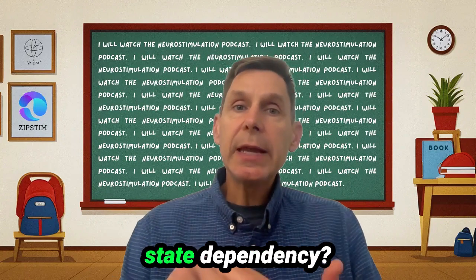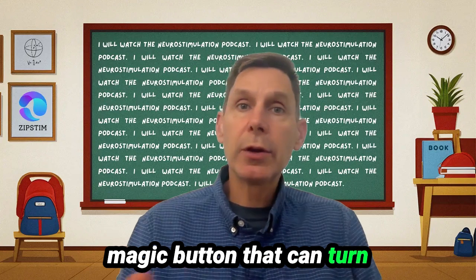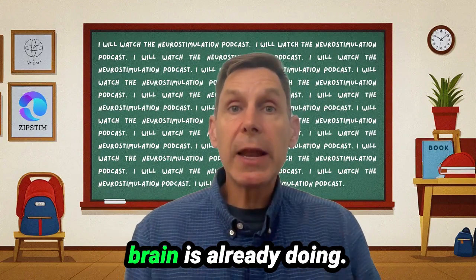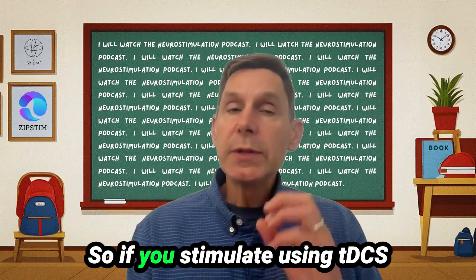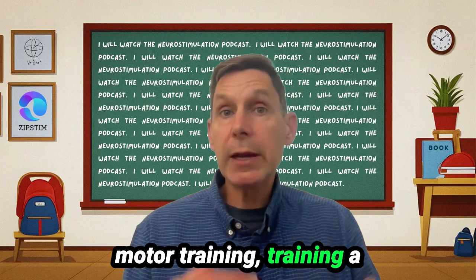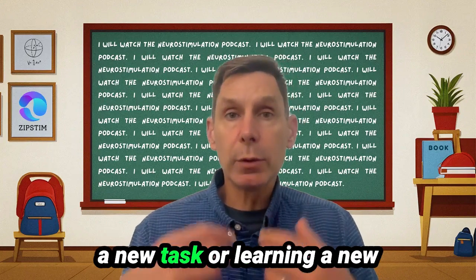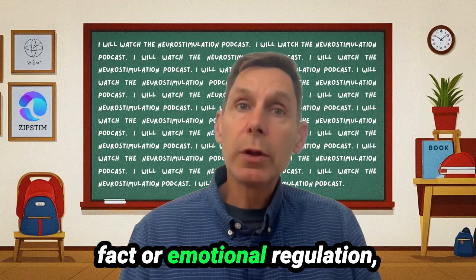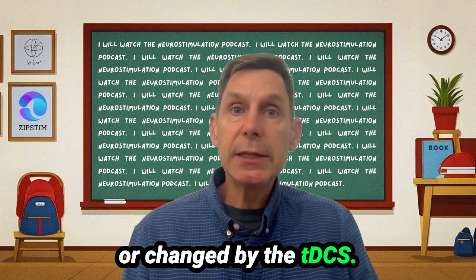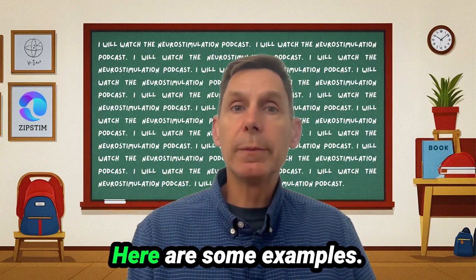So what's the role of state dependency? tDCS is not acting like a magic button that can turn parts of the brain on or off. Instead, it appears to be interacting with what the brain is already doing. So if you stimulate using tDCS during a task, for example, motor training, training a particular kind of movement, memory encoding, so learning a new task or learning a new fact, or emotional regulation, the effects can be enhanced or changed by the tDCS. This kind of effect is called state-dependent neuromodulation.